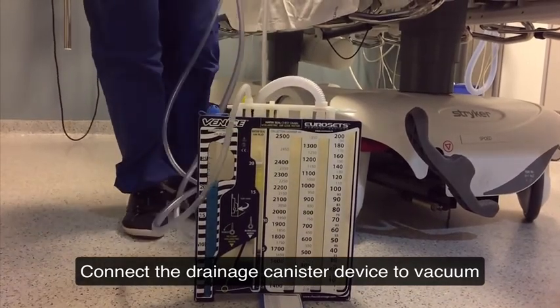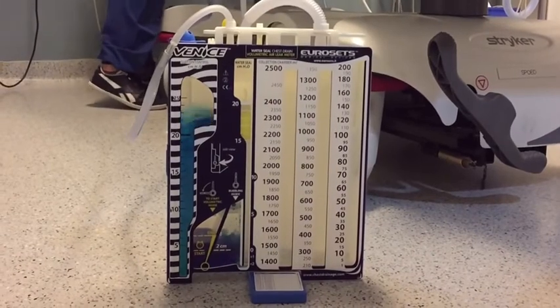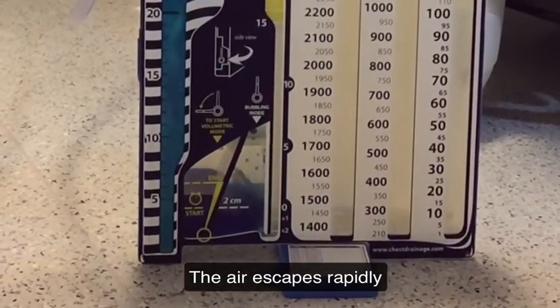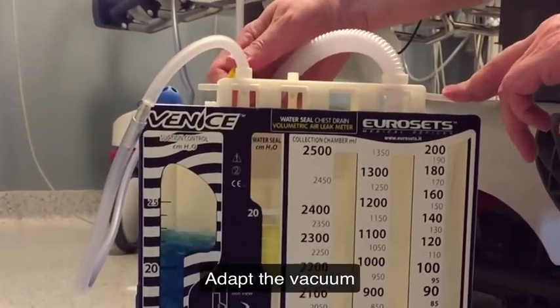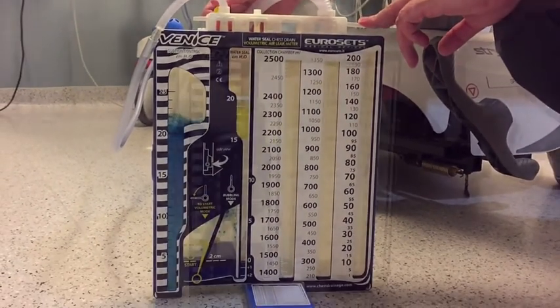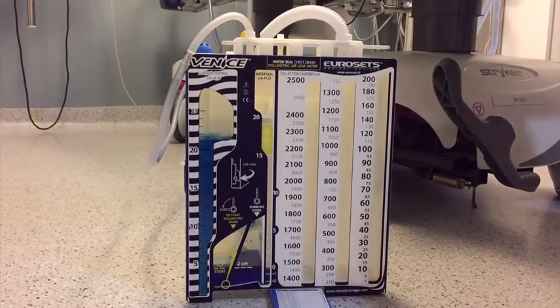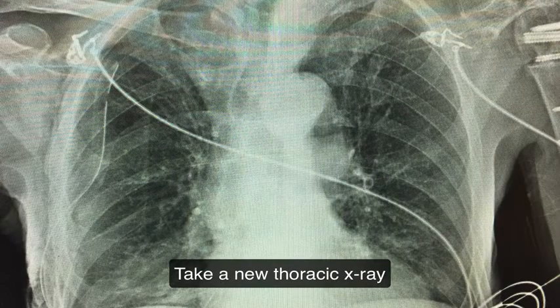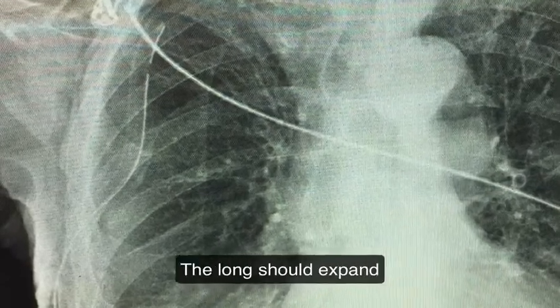Start the vacuum and see how the air bubbles in your canister device. Adapt the vacuum if necessary. And finally, take a new X-ray to check for the tube position and the lung expansion.